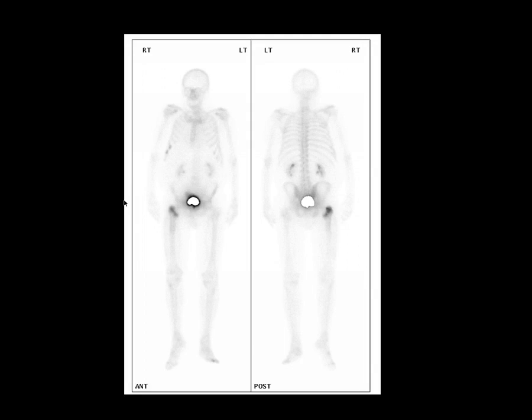Here's a patient who fell at home and fractured their right hip. We can see activity along the distribution of an intertrochanteric fracture line. The bone scan was performed because the team was concerned the fracture appearances on plain radiograph were malignant — they weren't. This is the normal appearance of a fracture. This uptake is in the pattern we would expect from an acute fracture.